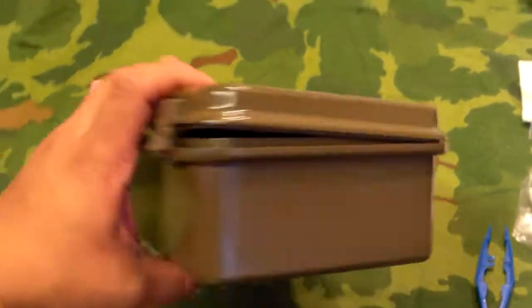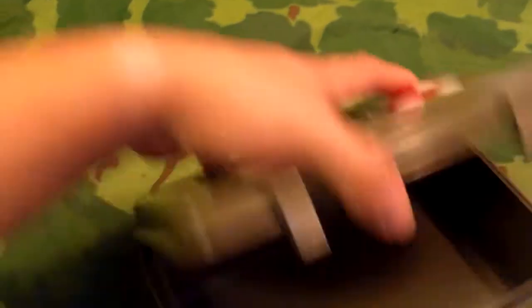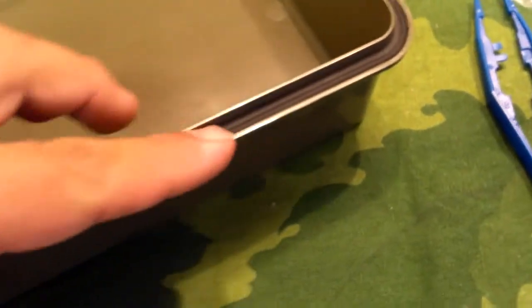Now that we've got all the contents out, we can take a better look at the case itself. It's probably the size of three or four VHS tapes stacked on top of each other. On the inside it does have a foam — or maybe rubber, I can't tell — but it has a waterproof lip, so it's a very nice case. It's got two plastic clips that latch it shut.